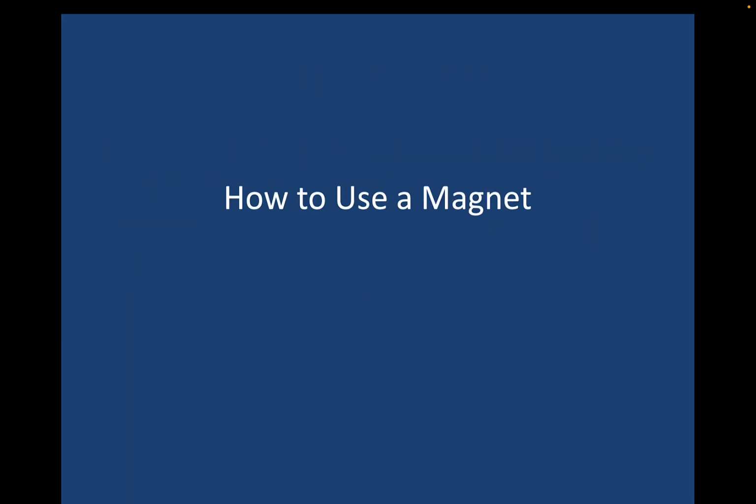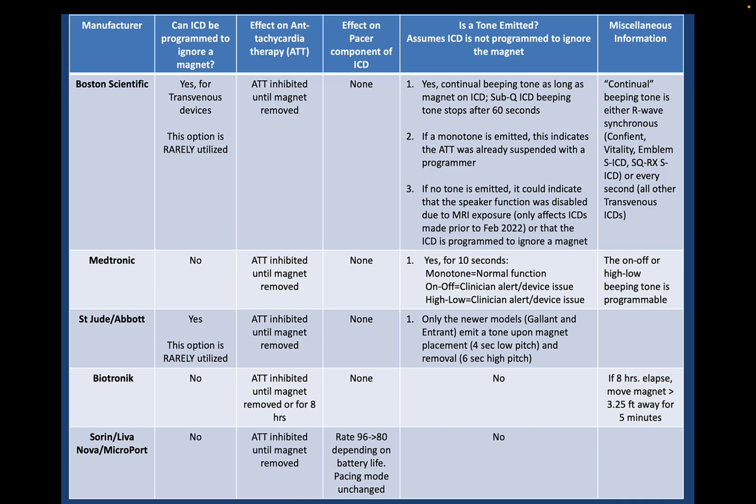Now, anesthesiologists often use a magnet to suspend the anti-tachy therapy to prevent situations like I've just described. And what I want to do is make sure that you are all experts at using a magnet in the operating room when you need to do so.